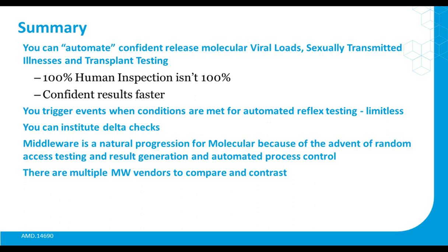But the advent of random access testing from vendors and quick results being generated and automated process control being much more evident on the instruments, to me speaks clearly to the need that we need to be able to release those results confidently as they're made available and not be stuck in our batch mentality.